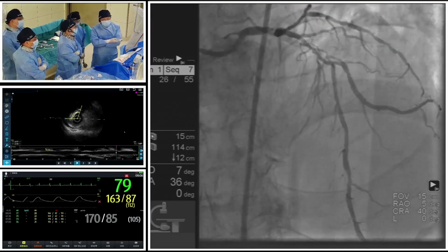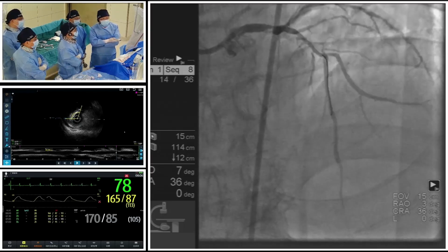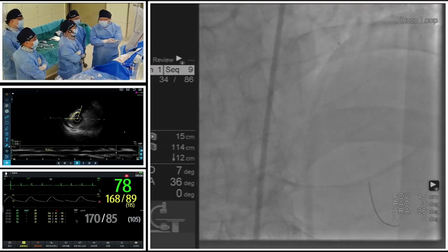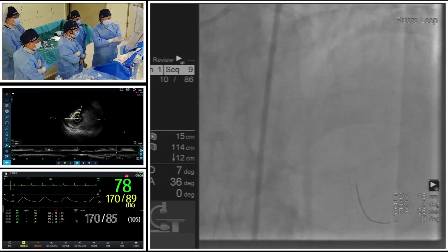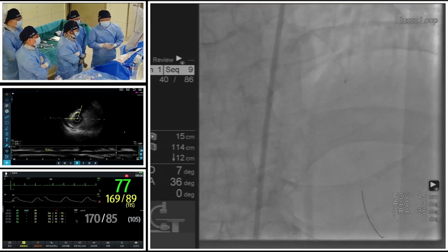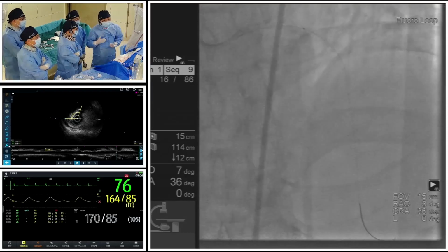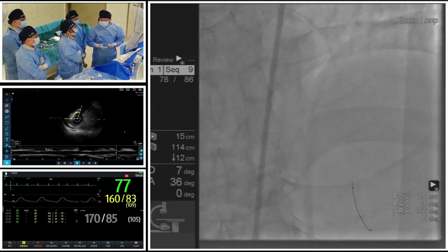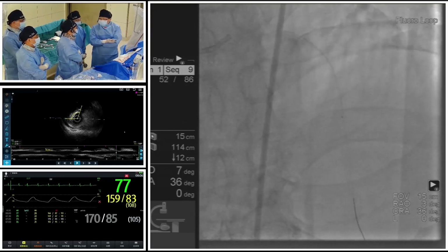So in order to better debulk the left main calcified lesion, we choose active Rota technique. As we know, today's key point is also IVL, but compared with IVL, Rota could better debulk and reduce the plaque burden of the left main calcified lesion.